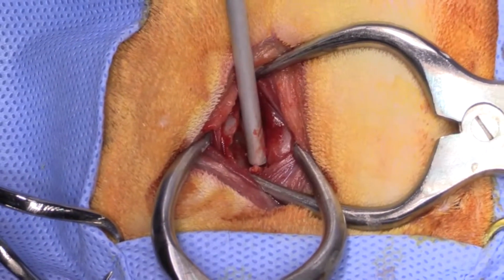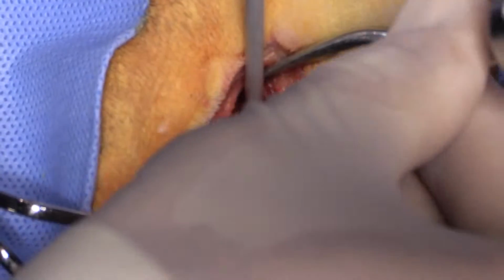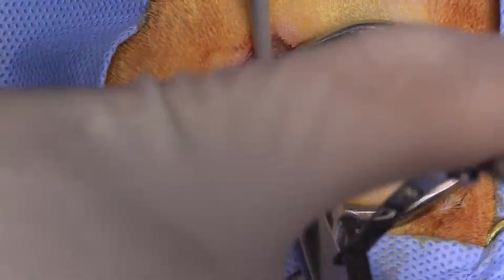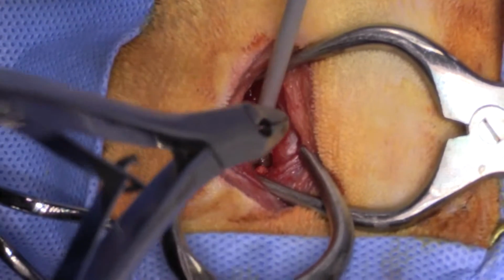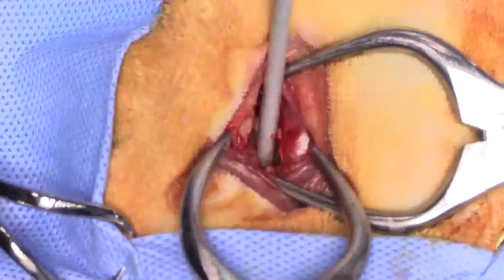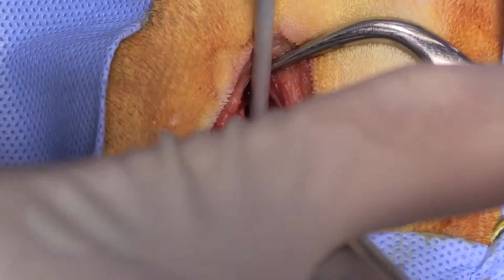All right, so what are we going to do now? We're going to open up the dorsolateral compartment. And that septum is much thinner than the external wall of the bulla, so I've already dropped right in there. And this is full of polypoid tissue as well. And sometimes I'll take the lateral wall of the bulla out, and then I'm actually looking into the ear canal, basically.